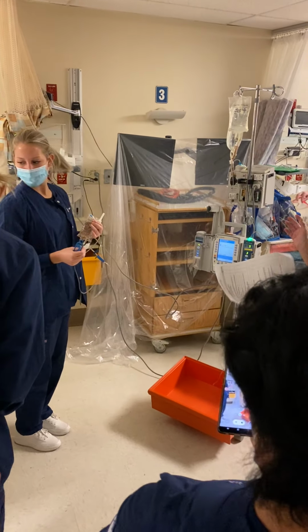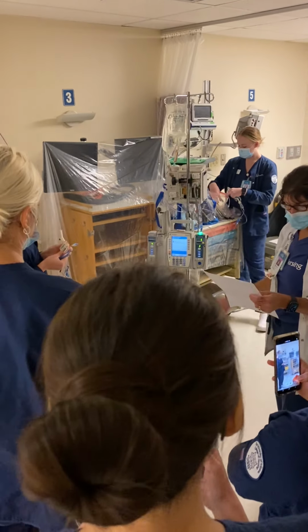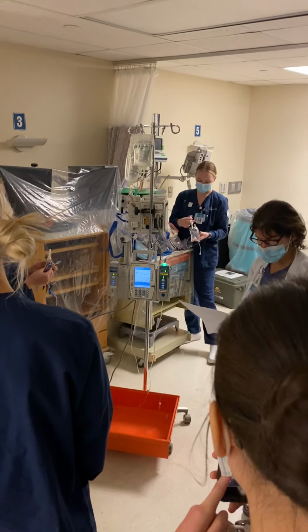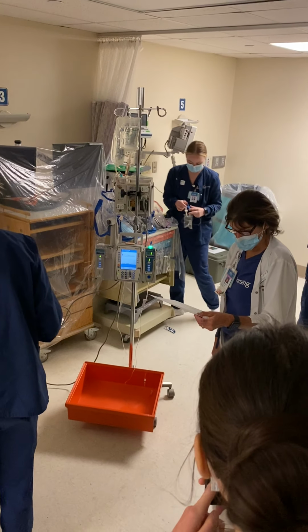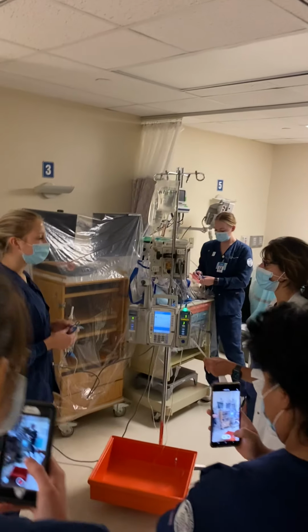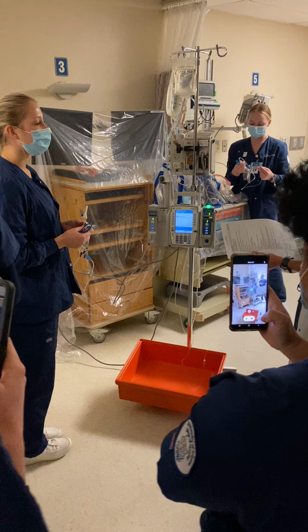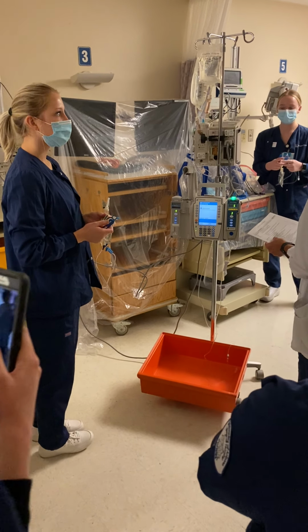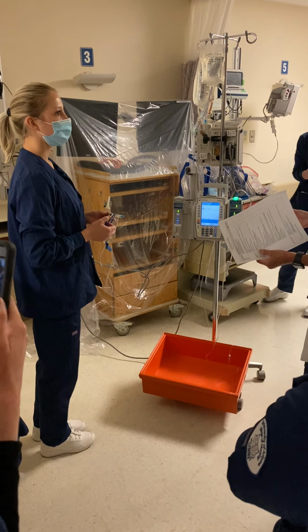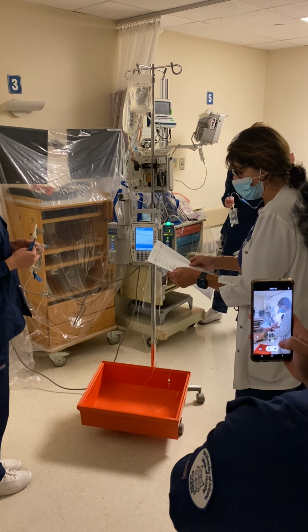Okay, so now again, you're gonna do hand hygiene, you're gonna walk into the room. This one doesn't even tell you to introduce yourself, does it? But again, I would still introduce yourself and tell the patient that you're gonna be giving an IV piggyback medication. You wanna ask, have you had this medication before? Have you had any issues with it? Do you have any questions? You know, all that good stuff.